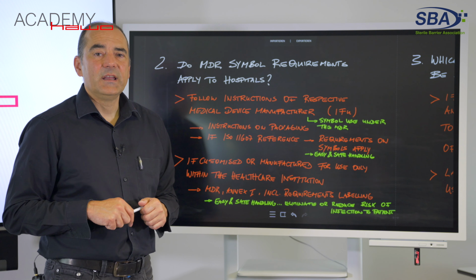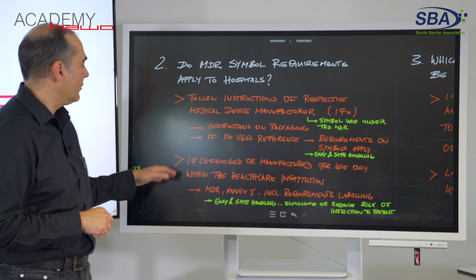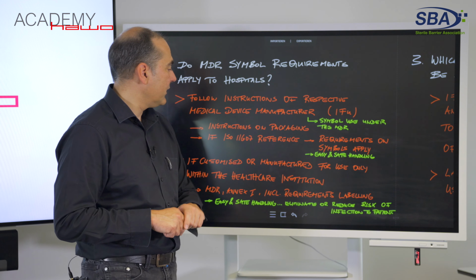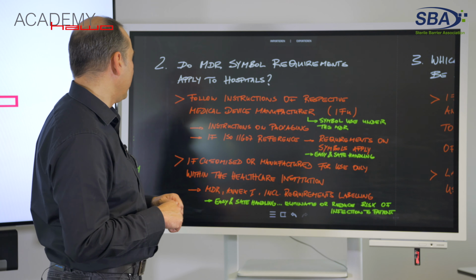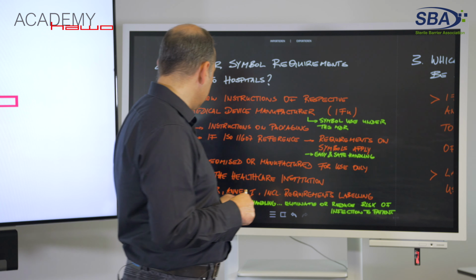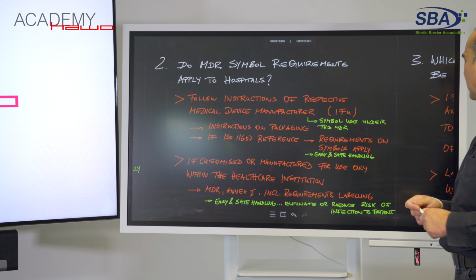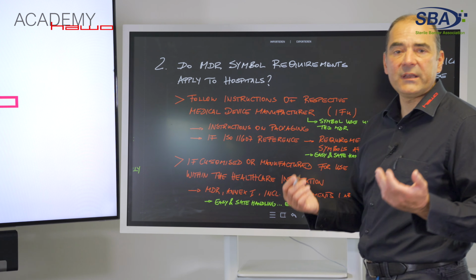If sets of instruments are customized or manufactured for use only within the healthcare institution, then MDR Annex 1, including requirements on labeling, applies. The underlying notion again is easy and safe handling, and elimination or reduction of risk of infection to patients.